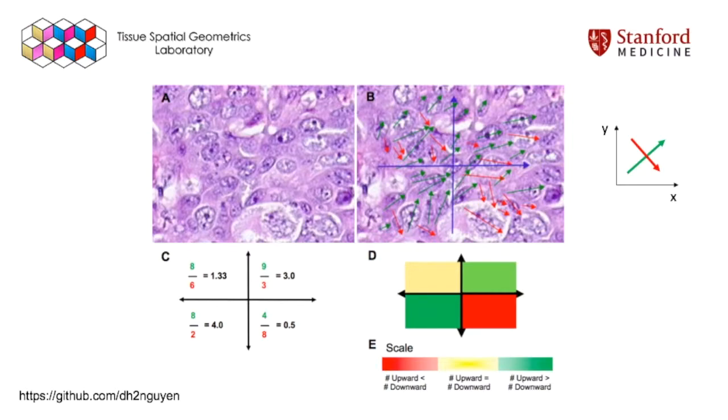So the quadrant slope index method takes an image of a tumor and divides it into quadrants, in this case 4 quadrants. And in each of the quadrants, we measure the longest length of each nucleus, and then we measure the slope of the angle that straight line makes.